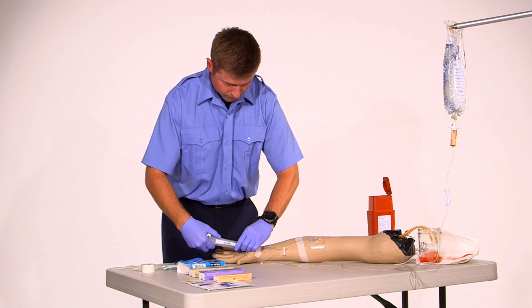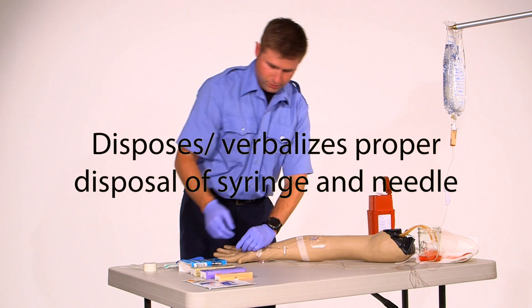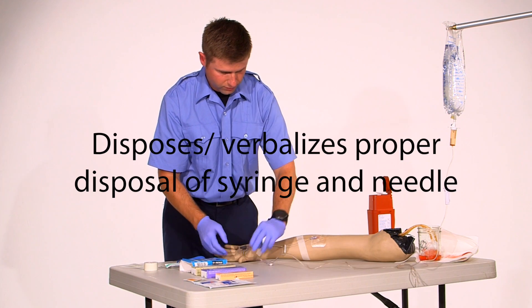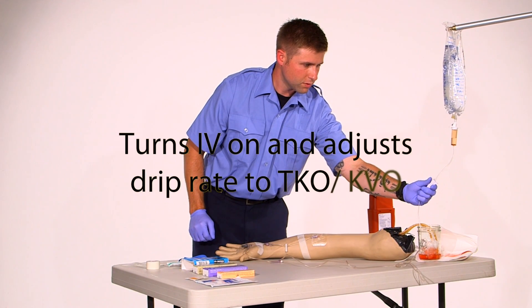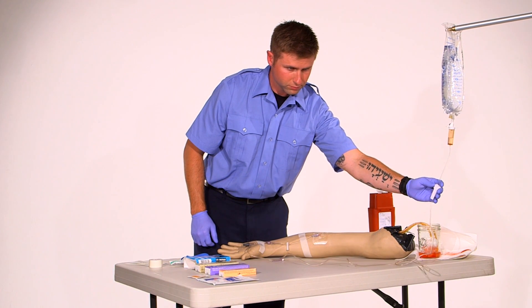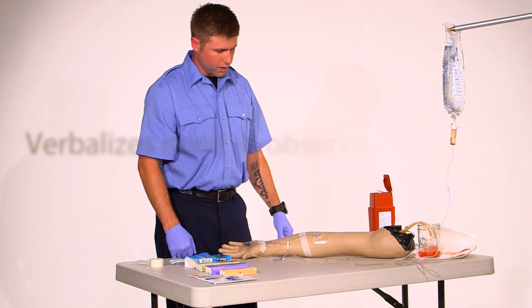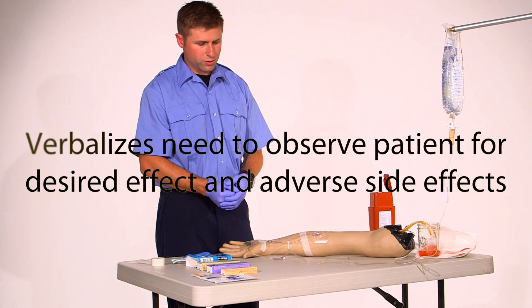Push the dextrose. Pull the line back up. Put the saline run. And I'm going to observe for any desired or undesired effects on my patient.